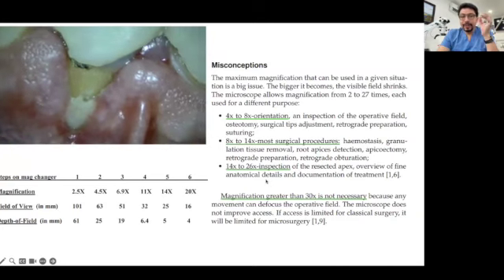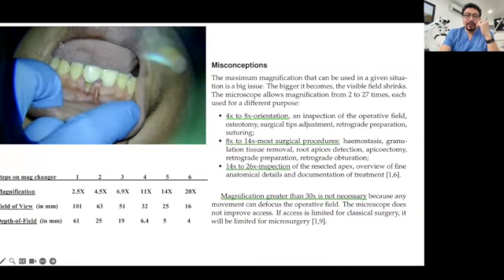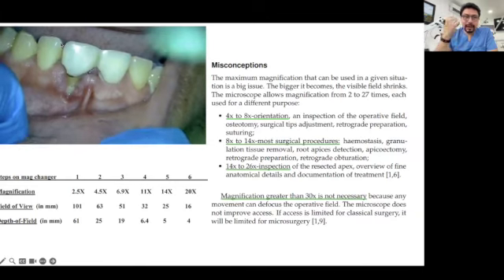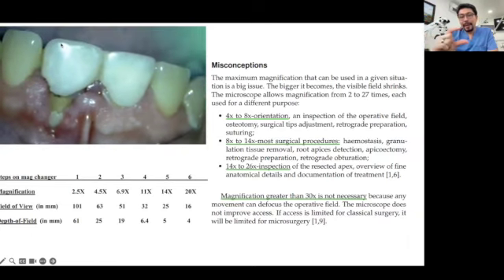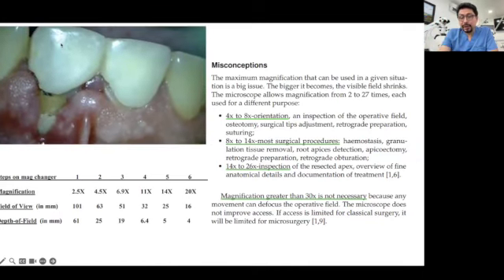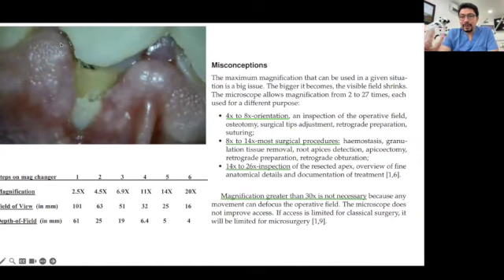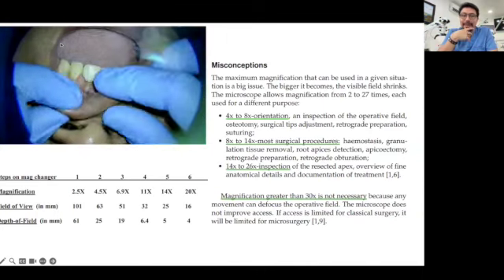That's why it's a big mistake to try to work in the higher magnifications. You are going to be frustrated if you want to do your procedures at the 6th step, in 20x or 24x. Your patient will move a bit and you will be out of focus. If you work in the 5th step of magnification, maybe the molar will be in focus or the anterior teeth will be in focus, but if you try to use the mirror, you are not going to have good focusing in the area. Or if you use the bur, you are going to have good focusing on the bur or on the tooth, not both at the same time.